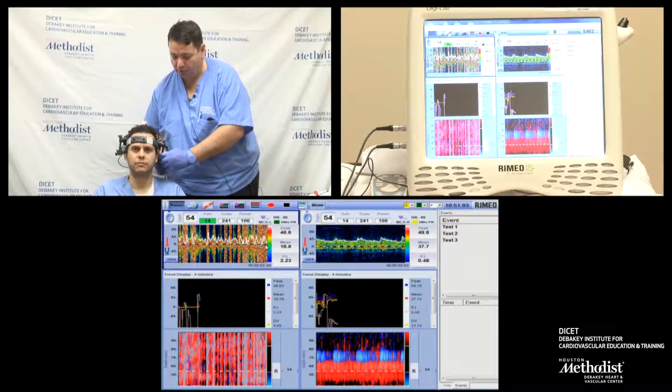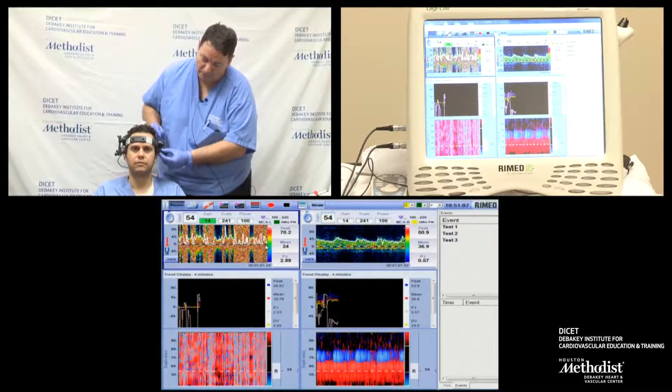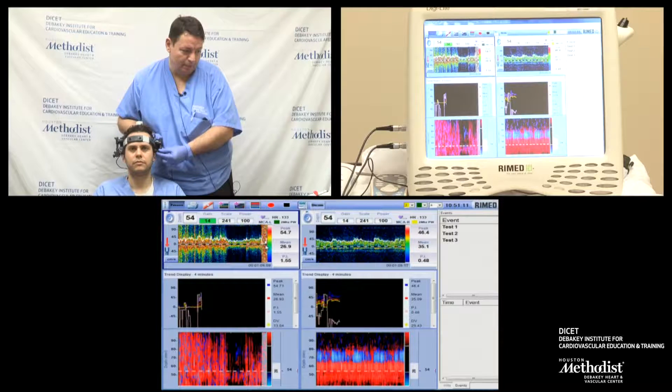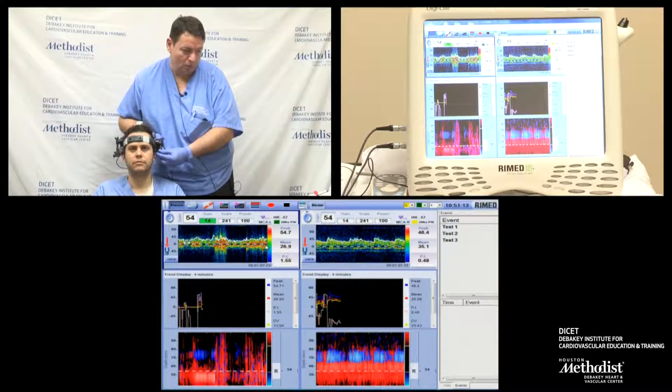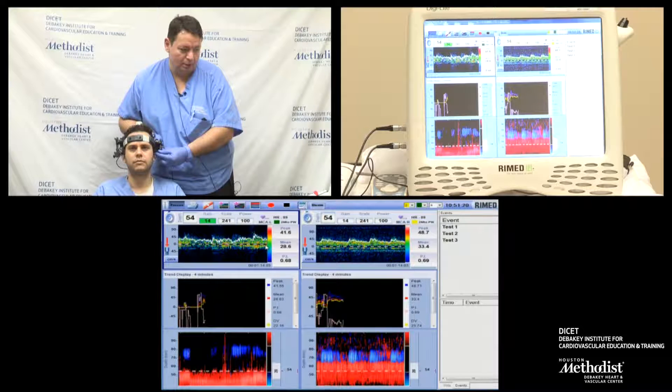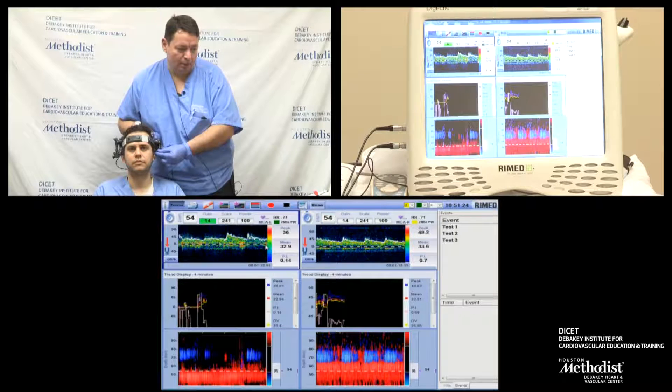So now I'm going to place the second probe, again angling a little bit anteriorly and up. When I see the signal above 50, I'm angling too high, so I'm going to point down a little bit — pointing down until I'm happy and locking the signal.